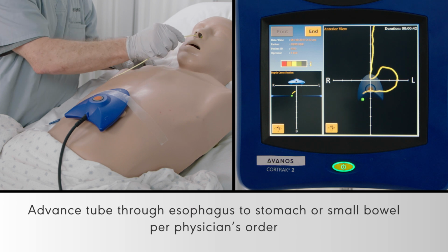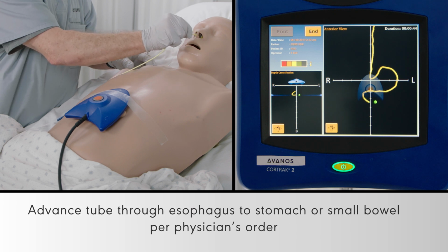Advance the tube through the esophagus to the stomach or small bowel per physician's order.